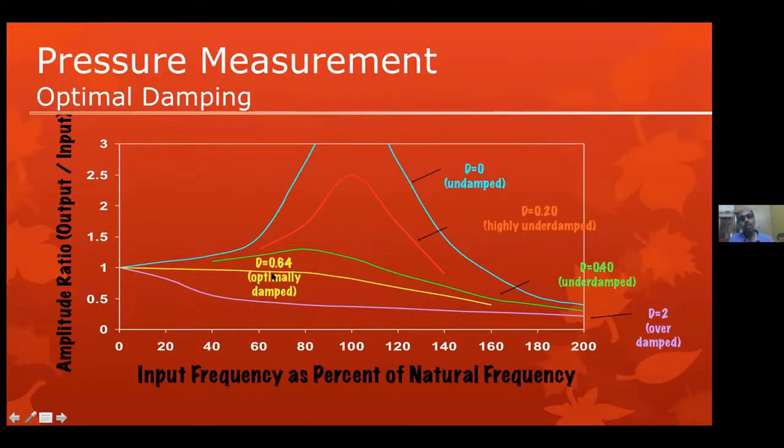So now coming back, let us assume that this natural frequency is somewhere around 60 Hertz, anything that is happening up to 20 Hertz I will easily be able to capture. So most of the clinically used good transducers in the cath lab will have an ability to assess pressures that are appropriate for cath lab measurement purposes.